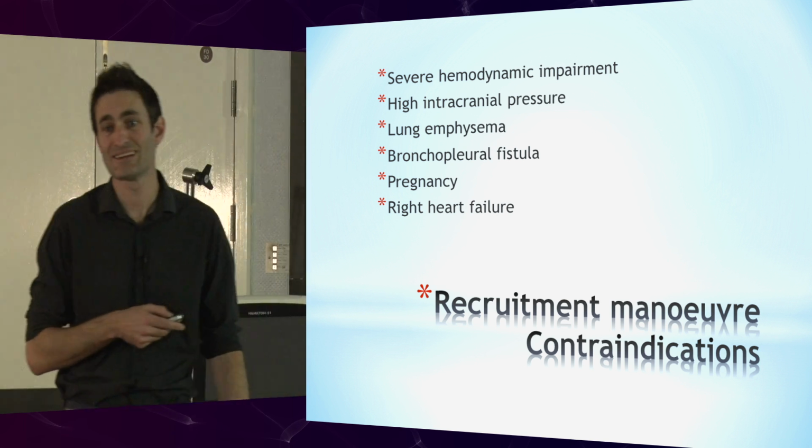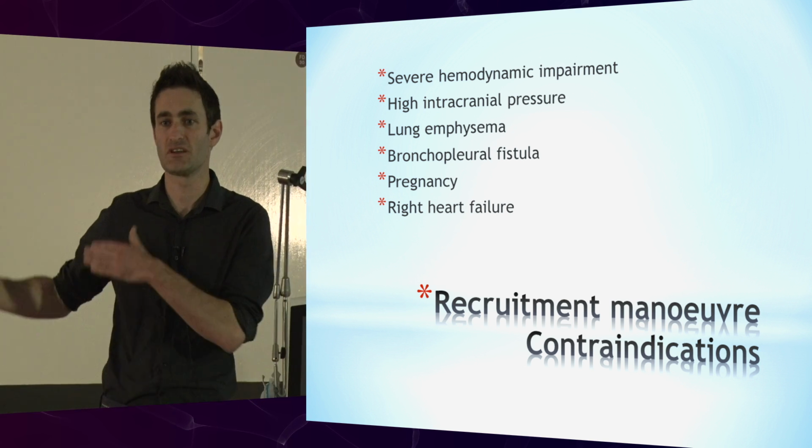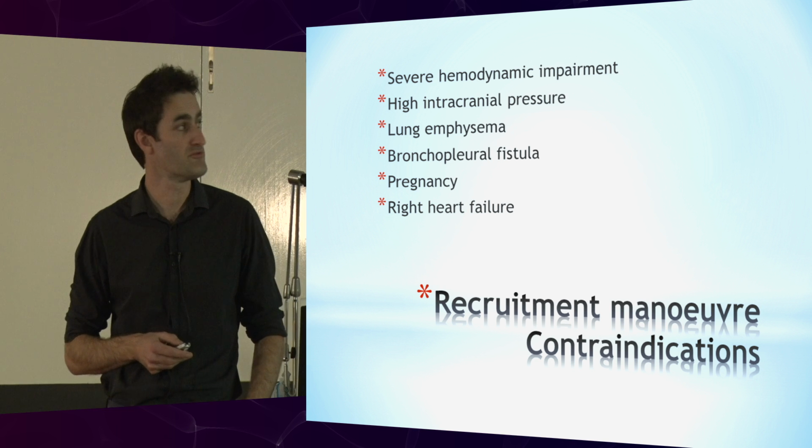Likewise, if you've got a big leak in the system, it's all just going to come out through the leak and you're going to worsen your fistula. Okay.